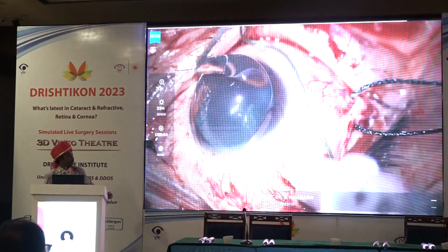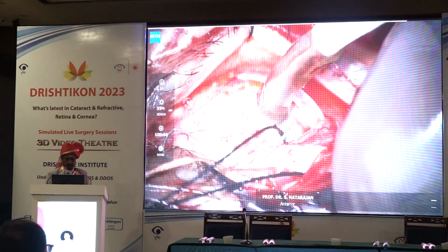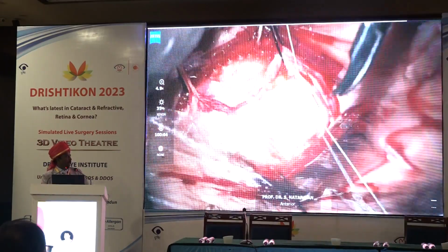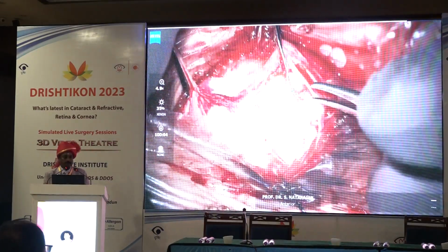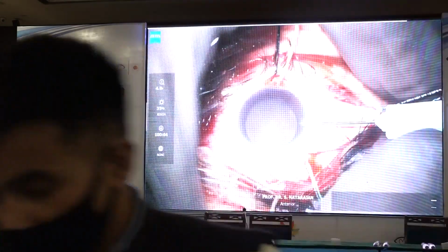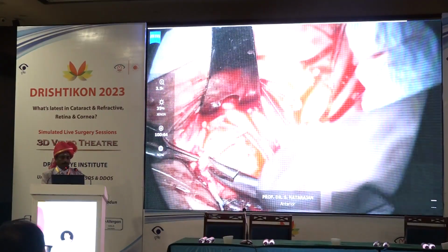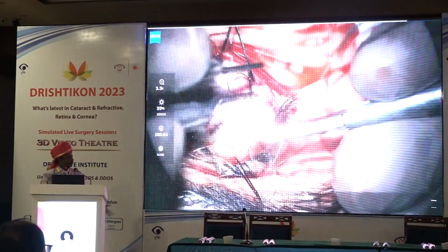But then I told him, this is just to make a single air bubble, where I do the single bubble thing. So here, in case you have a suspicion of any complication, it's under the buckle. We do a cryo and also check internally, and you can see the knot comes on the center of the buckle, which is well covered by the conjunctiva, so that even the scleral sutures are not exposed. And I do a paracentesis in case you have to make the intraocular pressure normal, and also the buckle height less, and finally have an internal support, which is a non-expanding gas bubble or even air you can use.